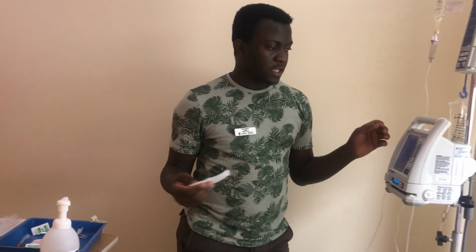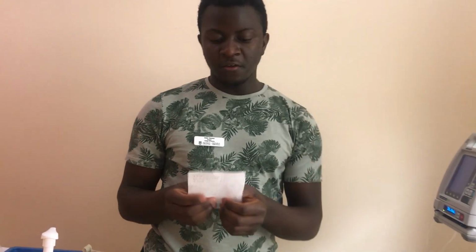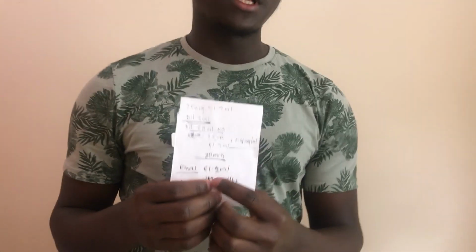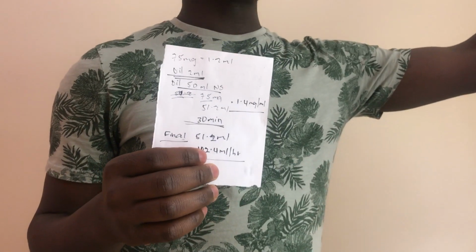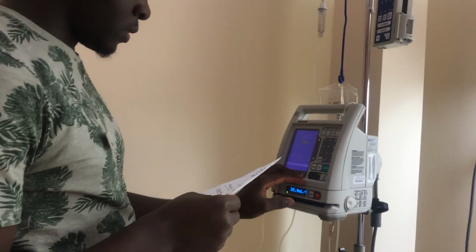So once that is primed, before this I did my calculation, and my final volume for this medication would be 51.2 milliliters, because I'm diluting with 50 milliliters of normal saline, and my dose of medication was 1.2 milliliters. So my final volume is 51, and the rate that I will be running for this pump is 102 milliliters per hour. So I will go ahead and set my rate now. I'm going to check the site for any infiltration, phlebitis, if there's any pain.